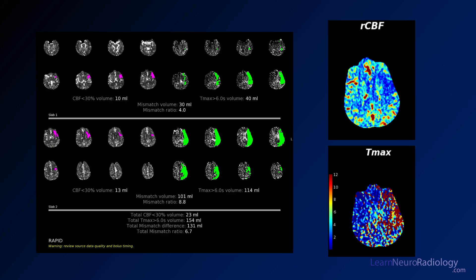If we look at the TMAX maps, we see a larger area of tissue at risk involving a lot of the MCA territory, maybe a little bit of sparing of the ACA territory, maybe even parts of the PCA might be involved. Cerebral blood flow is decreased in that area in the left insula and MCA territory, but a bigger region of TMAX going throughout the whole left cerebral hemisphere.